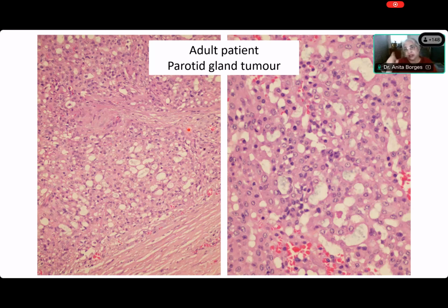Here you're seeing spaces, very irregular spaces. There is no cribriform pattern forming here. These are not punched out areas where each one is so regular, but they seem to be sitting in the sheets of cells. Now, can you describe the cells, please, Madhu? Ma'am, cells are showing abundant eosinophilic cytoplasm, and there is a round to ovoid nucleus with very prominent nucleoli. Very good. So they are pink.